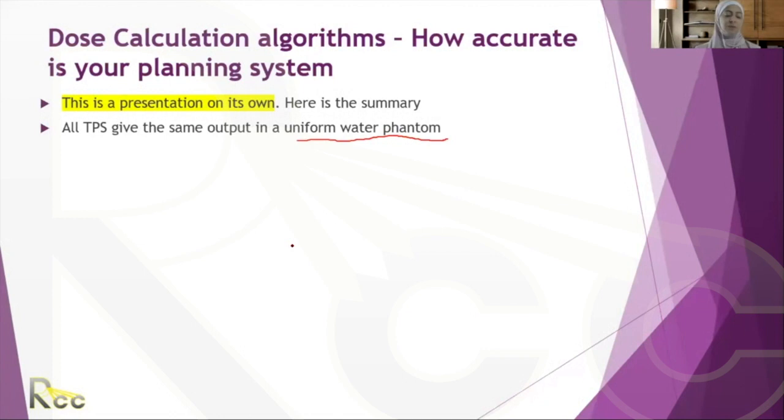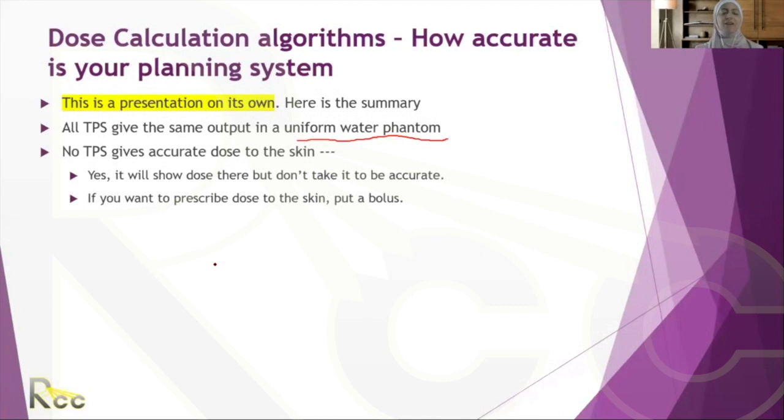And depending on what we call the calculation engine, either you have a good quality engine, like a 3000 cc car that you can take up and down hills and you're fine. I always like to use car terminology when I describe a planning system. I find that it expresses the idea well. So you have to know what calculation engine you are using, and you have to know certain facts about the calculations of the planning system that you have.